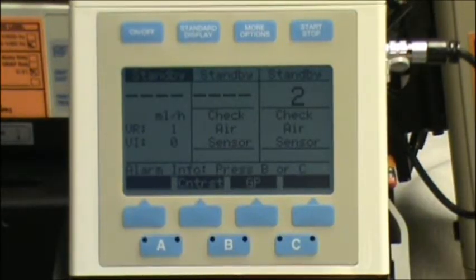In this training I'm going to show you how to program vasopressin into the triple channel pump. So the first thing I'm going to do is change the device mode on the triple channel from GP to GP2.